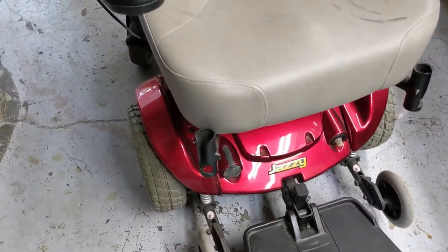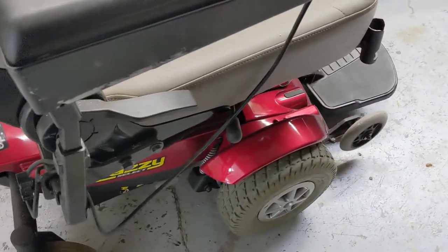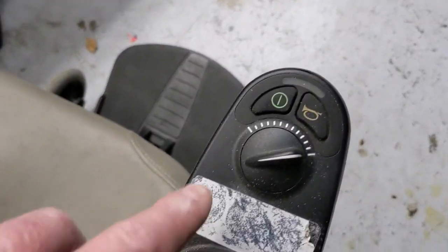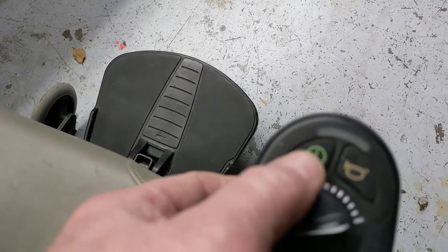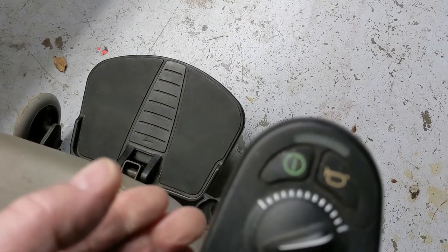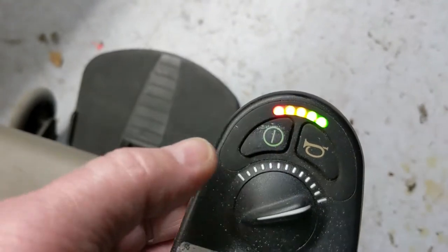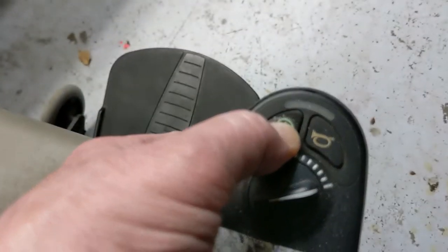I'm working on a Jazzy power chair and a lot of these have issues with powering up. This one's no exception — it has a fully charged set of batteries but the button is not responsive. Every now and then it will power up, but it is not responsive to the button.